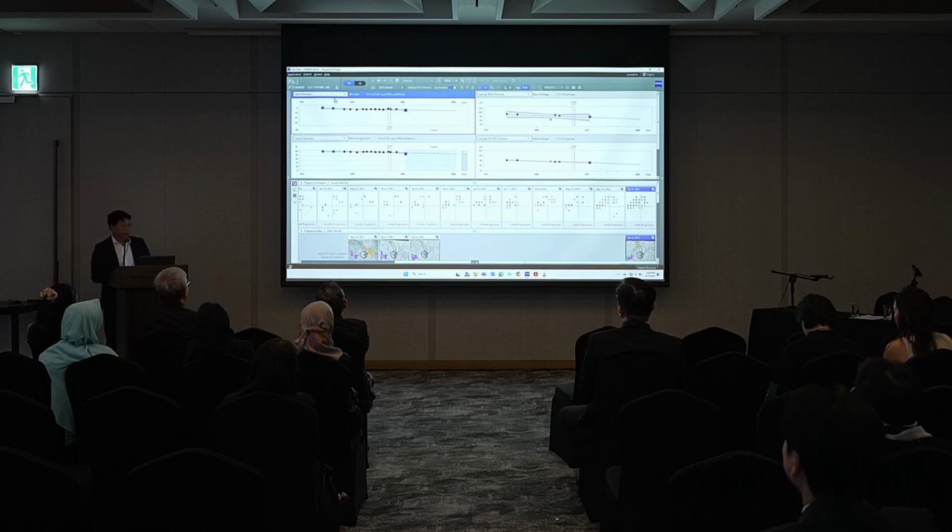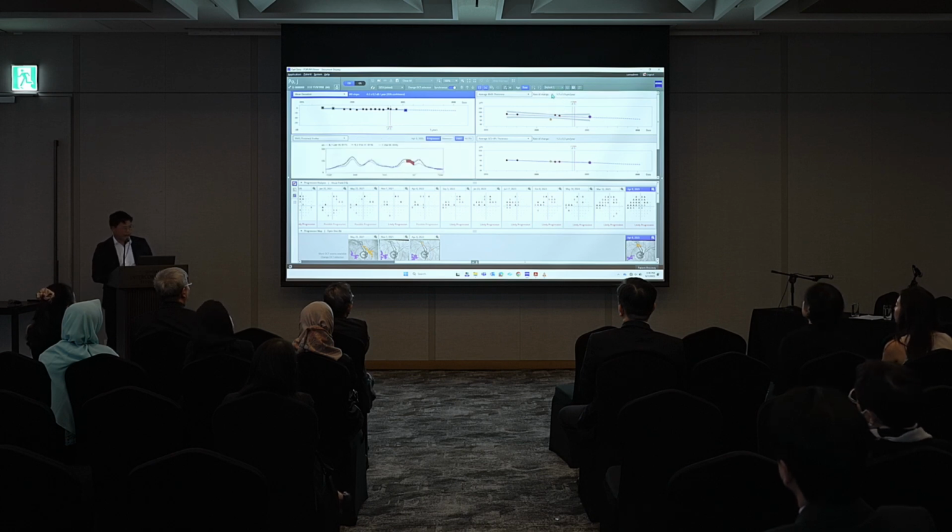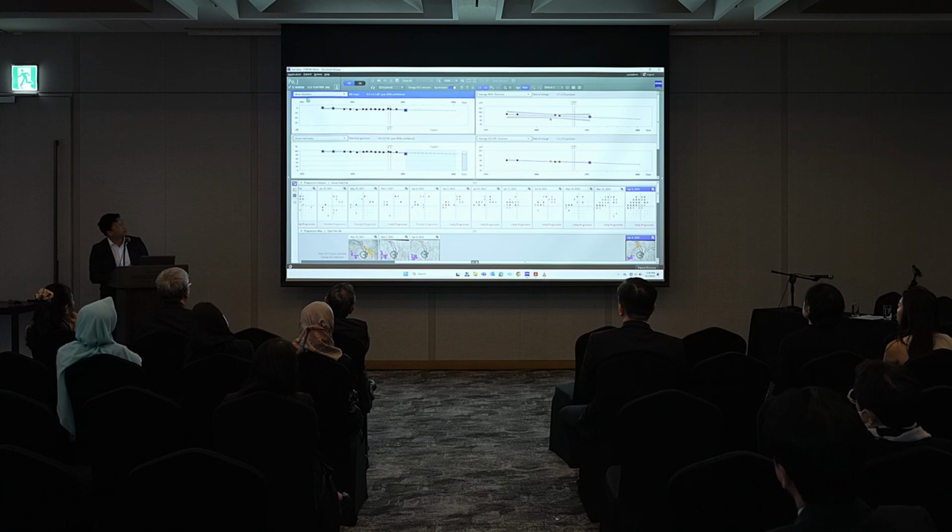Now, just to be aware, you can actually select how you want to view the patient's information yourself. So this is customizable to you. You can actually have different profiles if you've got different surgeons or different people across different hospitals. And so here earlier, you can see that here's a default 1 display, here's default 2 display, and that's my typical display where I've got the patient's visual field index, mean deviation plotted, and average RNFL thickness, etc.